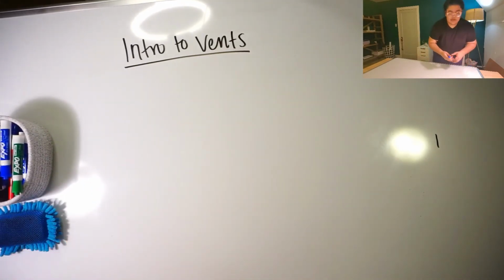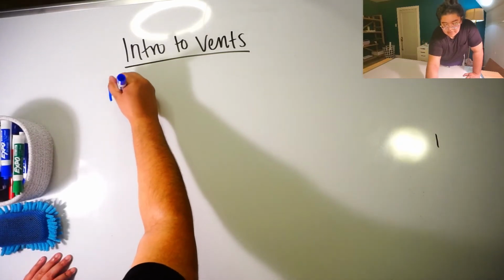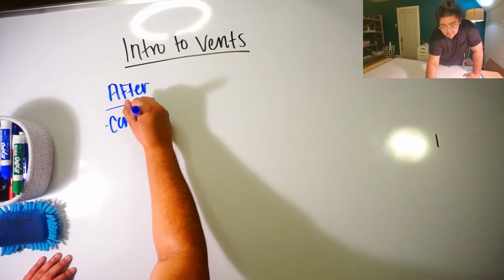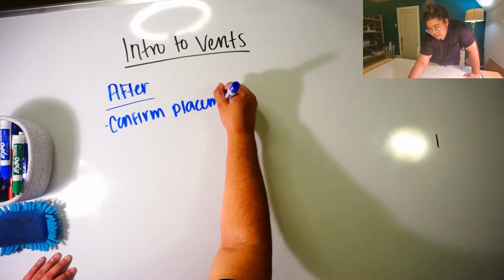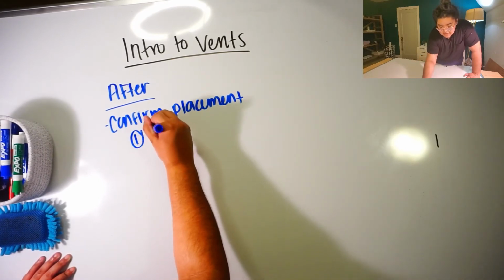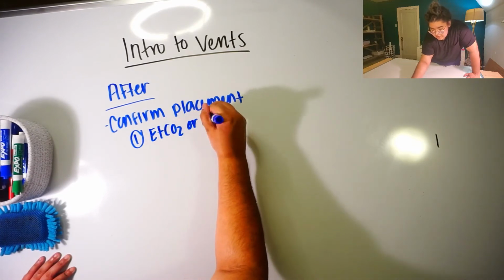What we need to do after the tube is in is we need to confirm placement. Okay, so after we confirm placement, we're going to do this a couple ways. First thing we're going to do is end tidal CO2 or CO2 detector.